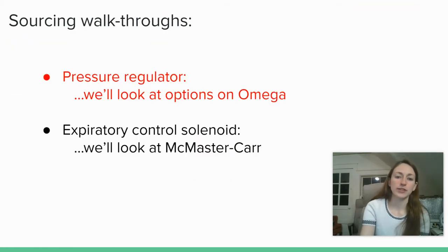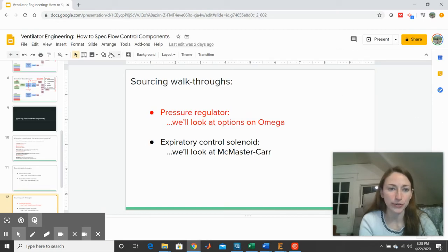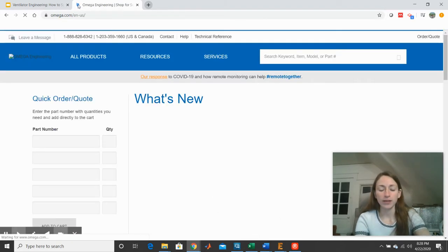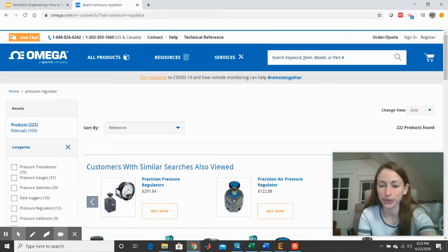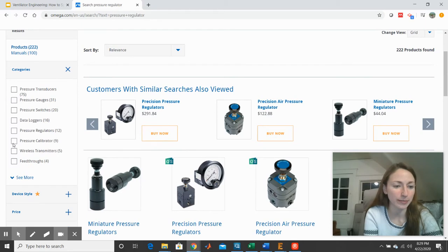So just to begin with the pressure regulator, let's do a walkthrough on their website. So I'm going to go to omega.com, and we're going to try looking for a pressure regulator. And I hope that even though this is a boring part sourcing walkthrough, that someone can benefit and be mindful of some type of spec that they may have missed.